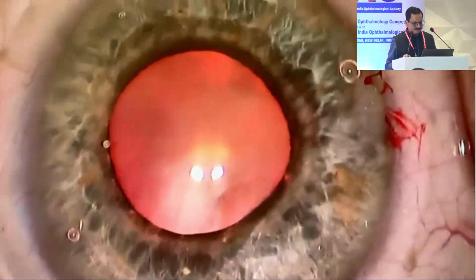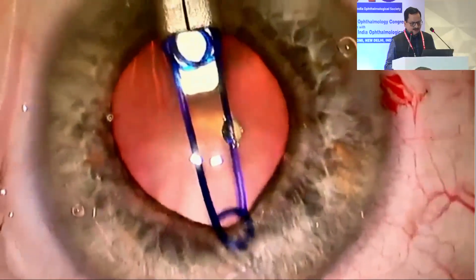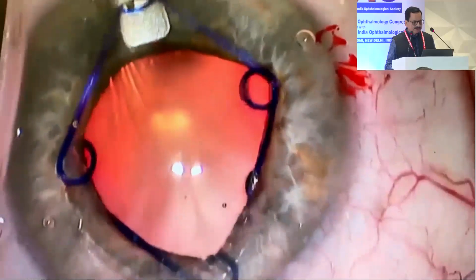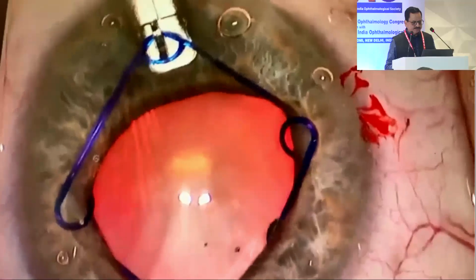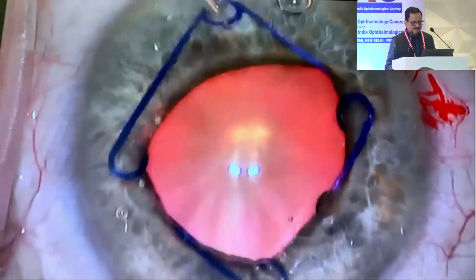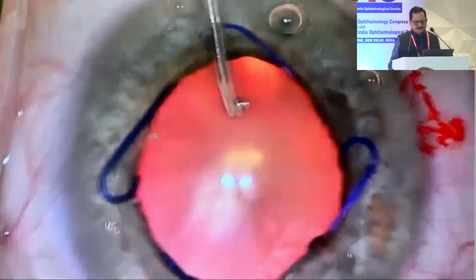This is Dr. Kachikian from the Eye Institute, and what you're seeing here is the early part of a cataract surgery with a small pupil. The device we are placing here is called a Malyugin ring, and we use this ring to expand the pupil to allow us to access the cataract and remove the lens safely. Each eyelet of the ring hooks onto the iris and holds it out of the way so we can do the procedure. As you can see here, once we get the last eyelet hooked, the iris is retracted very well. Placing the Malyugin ring in general is minimally traumatic, and removing the ring is fairly easy as well. So it's an excellent solution to a small pupil.